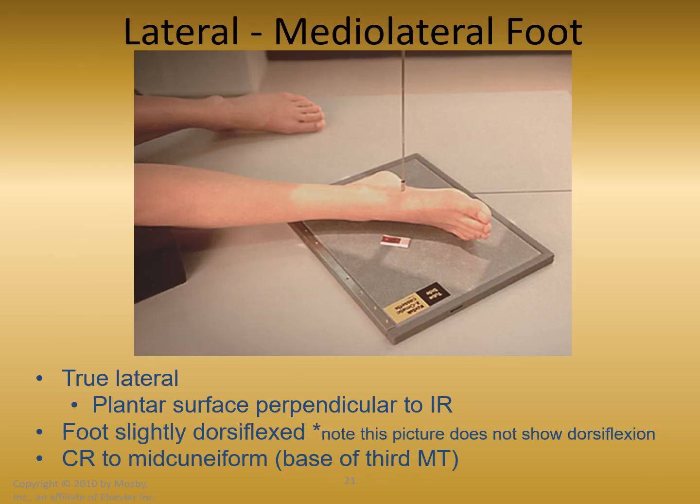On lateral foot positioning, we want to ask the patient to dorsiflex the foot as much as they can. That means bringing the toes closer to the tib fib, pointing the toes up towards the tib fib. That will be decreasing the angle between the tib fib and the toes. And then we'll palpate the plantar surface of the foot and make sure that the plantar surface of the foot is placed perpendicular to the IR to place that foot in a true lateral position.